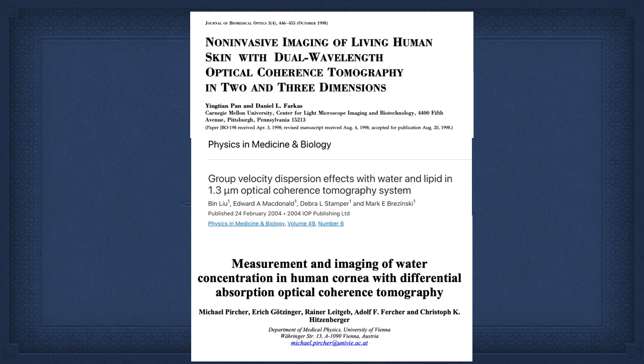But so we looked at, in the middle, group velocity dispersion, which is wavelength dependent dispersion. So when we send in an OCT beam, it's a bandwidth, it's a bunch of wavelengths. And not all wavelengths are affected the same way. So you get a distortion in the light reflected back. This is somewhat resilient to scattering, but the problem is you get all the dispersion from the tissue above the area of interest. And we found a way, we believe, to overcome this, and we're going to get back to it.